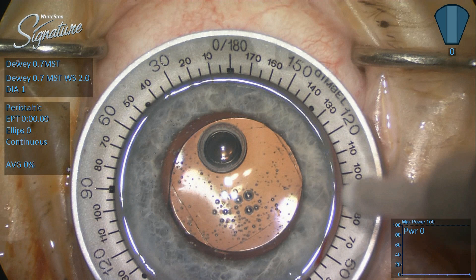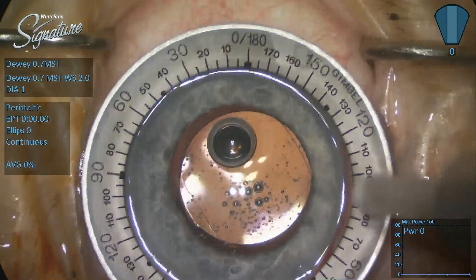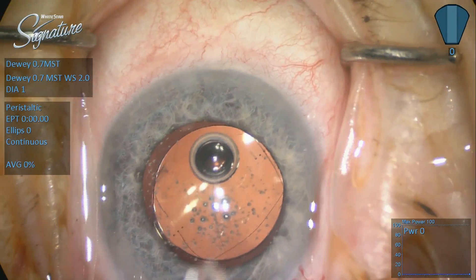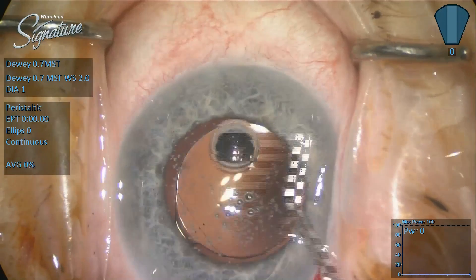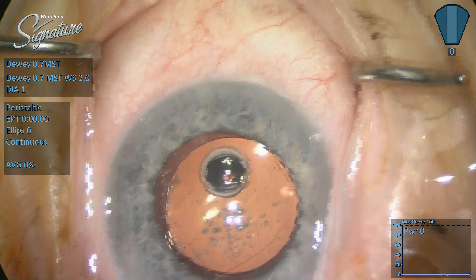My technician hands me the alignment marker, and I don't have any external marks — I just have the corneal marks. But it's a nice square capsulotomy at this point, wrapping around that optic with the reverse optic capture. She had a wonderful outcome: minus 2.75 plus 0.75 at 70, which is perfectly J1 at near — exactly what she wanted out of this eye. But it took two tries to get there. Thanks for your time. I hope you enjoy this case of reverse optic capture.